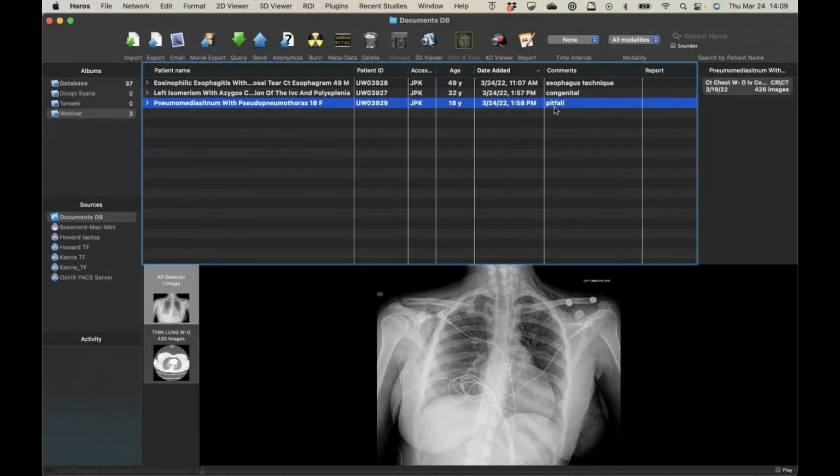All right. Just a point question for everybody involved. They always seem to get CTs for these patients. How many times have you actually seen an identifiable cause for the pneumomediastinum on the subsequent CT? Never, except the non-traumatic patient. Other than interstitial gas, never. You see the PIE, right. I just always try to explain that the chances of us finding something to do something with is almost none.